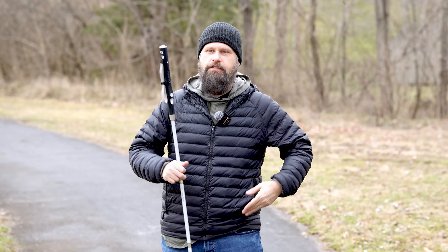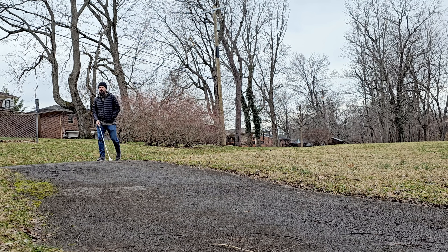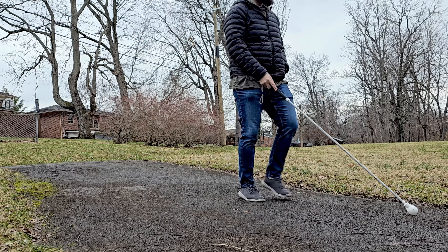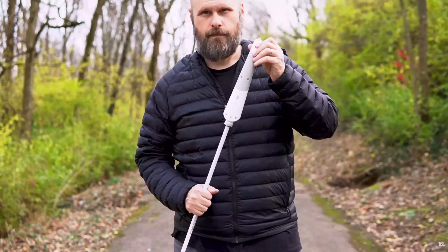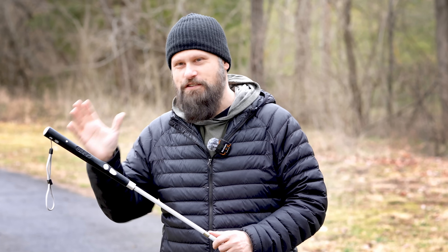This is the successor to the very popular WeWalk Smart Cane, and this version brings a ton of improvements over its predecessor. This is clearly a situation where the company listened to the feedback, took it to heart, and improved on every single thing. Obviously the first thing you'll notice is the brand new design. One of the biggest criticisms of the original WeWalk was the big bulky handle — I may have referred to it as a dust buster on a cane — but now WeWalk has improved everything about the cane.